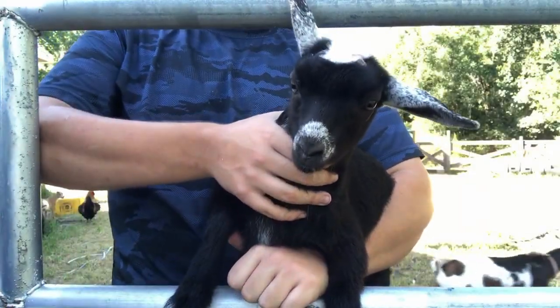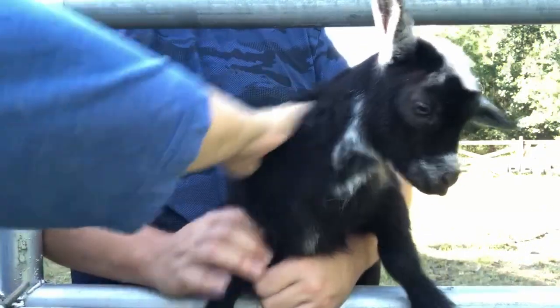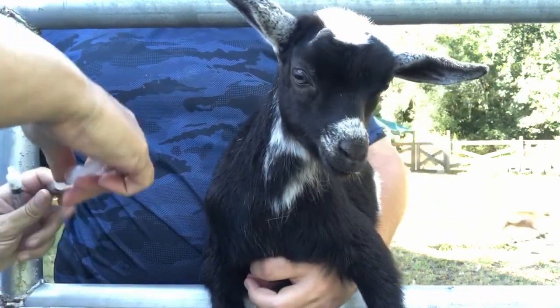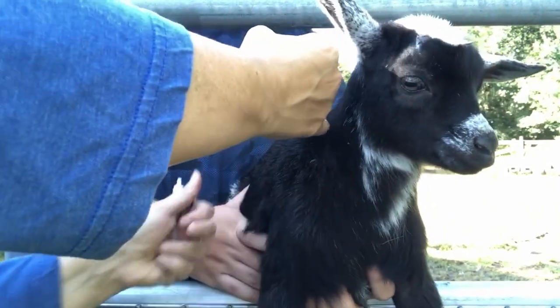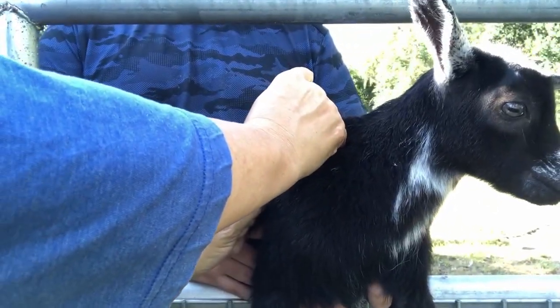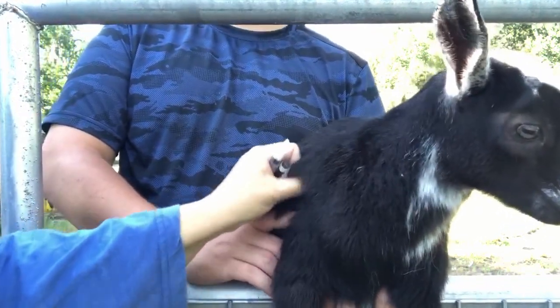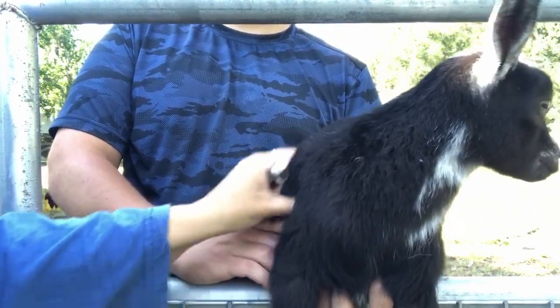Okay, this is our little doe Solstice. I'm going to put a little bit of the alcohol where we give her injection, right here behind the elbow. I'm going to pull up a tent of skin and then put the needle inside the tent and inject — sorry, the mama goat bumped us there. Then rub it — make sure you rub it real well so it doesn't leave a knot and it absorbs nicely into the skin.